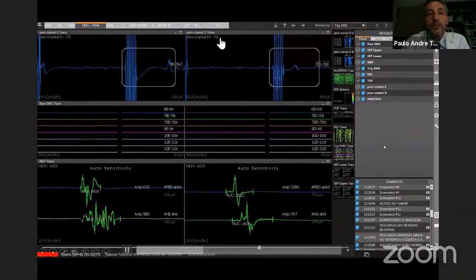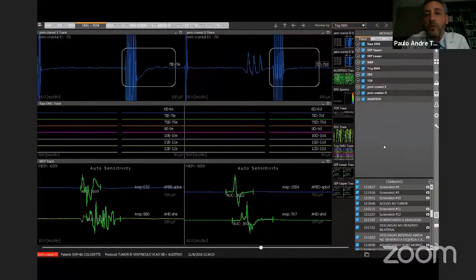It's still 70, but I will increase the response. Here, it's not constant, the response. Sometimes I have, sometimes not. And I don't have the response here. So I decided to increase.